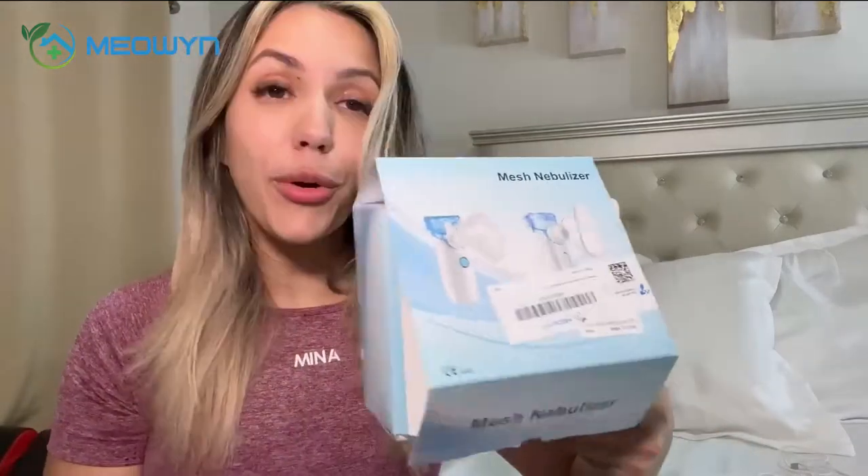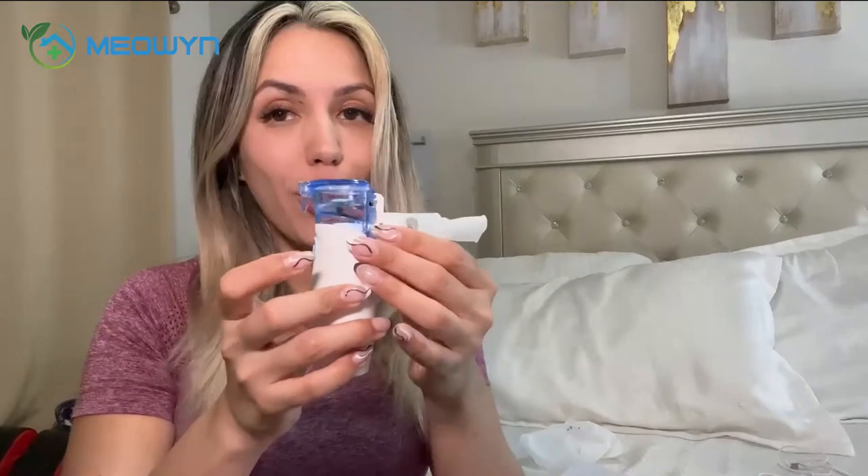I'm really excited to share this product with you guys. It's a portable mesh nebulizer by the Meowyn brand, and the reason I love it so much is because it's small, it's portable, and it's easy to use.